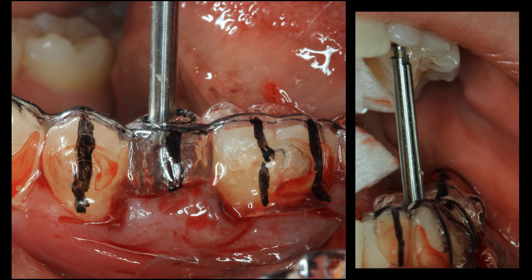Accidentally, since the hole was too large, the drill was positioned too far mesially rather than centered. On the right-hand side, the photo shows actual proper occlusion. The drill eventually occludes with the opposing arch. If we look closely, the drill also follows the line of the central fossae of the molars and the premolars on the bottom. Moving on, we took a radiograph.